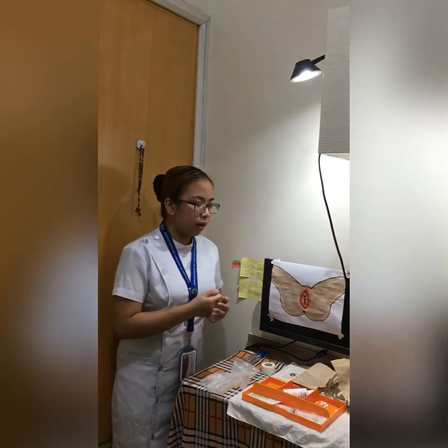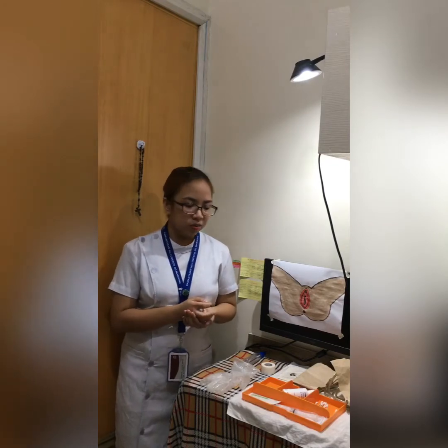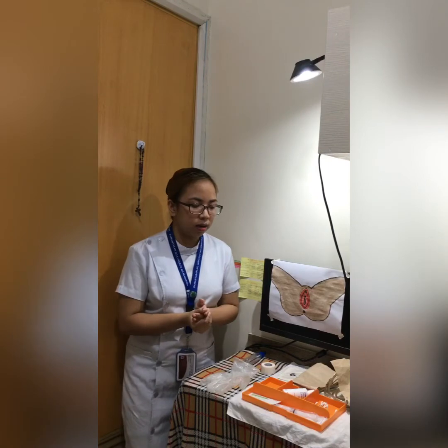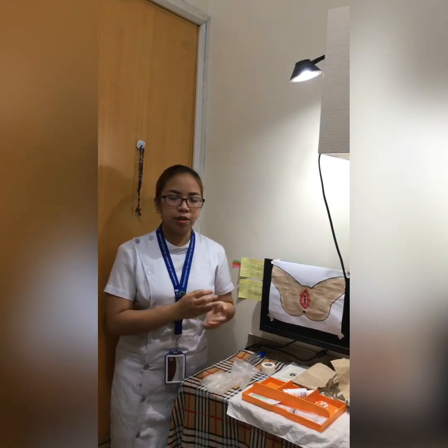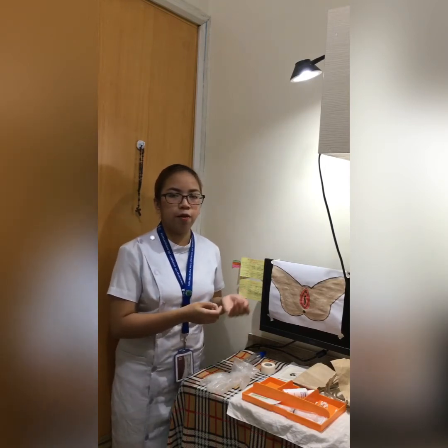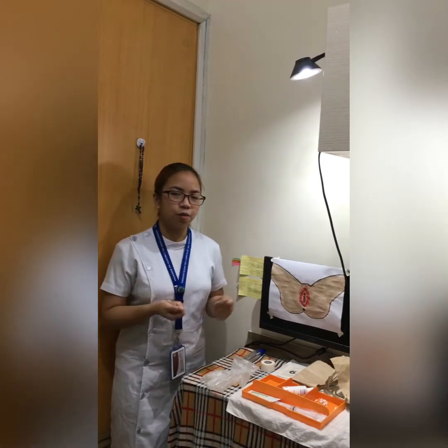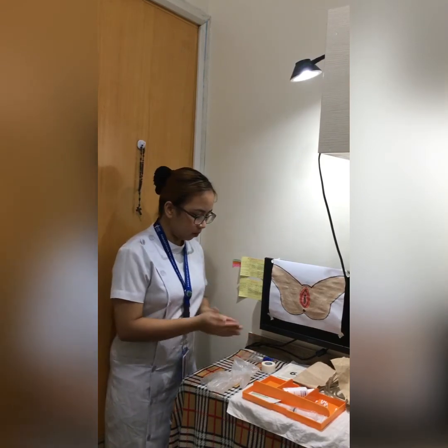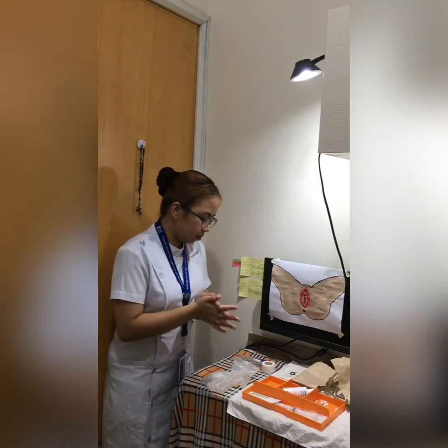A mistake in spreading the microorganisms in the sterile field may cause the patient to have infections such as urinary tract infection. So first I'm going to perform hand washing. Then I'm going to wear clean gloves.